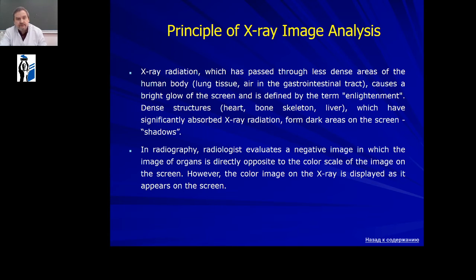In radiography, radiologists evaluate a negative image in which the image of organs is directly opposite to the color scale of the image on the screen. However, the color image on the X-ray is displayed as it appears on the screen.